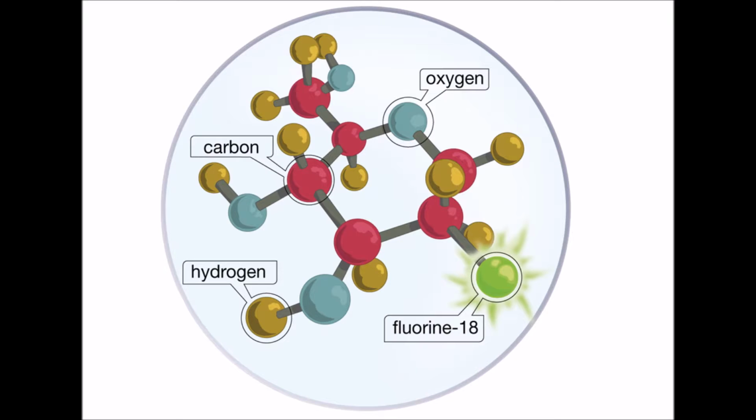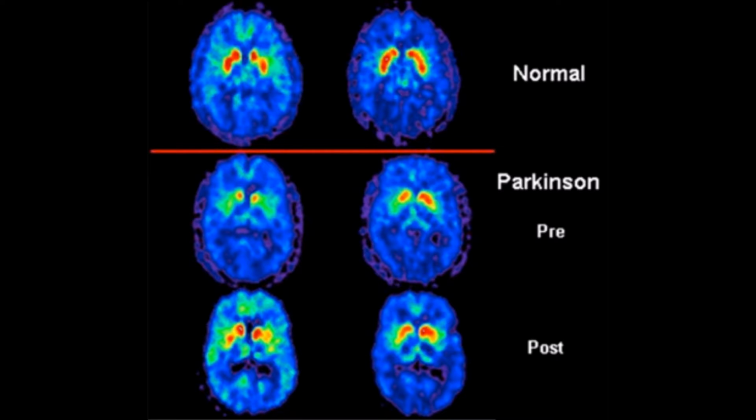This picture here is a picture of a chemical compound that your doctor would inject into you. This here has fluorine 18. Fluorine 18 is injected into the body and it causes two characteristic annihilation photons to be emitted from a point where the chemical has been concentrated by physiological processes. This can measure exactly the location of wherever your two gamma ray photons are going to be emitted.